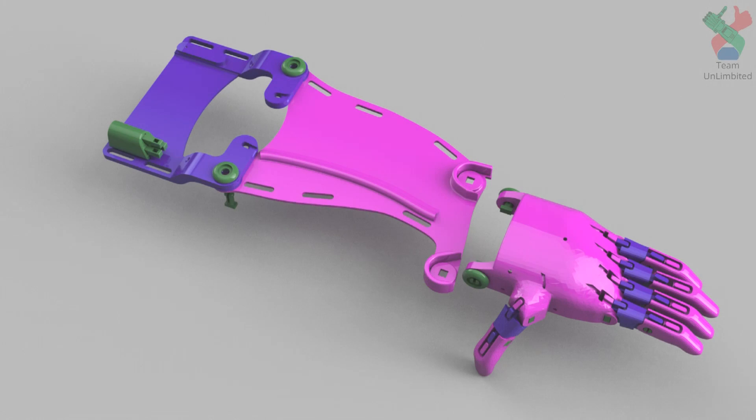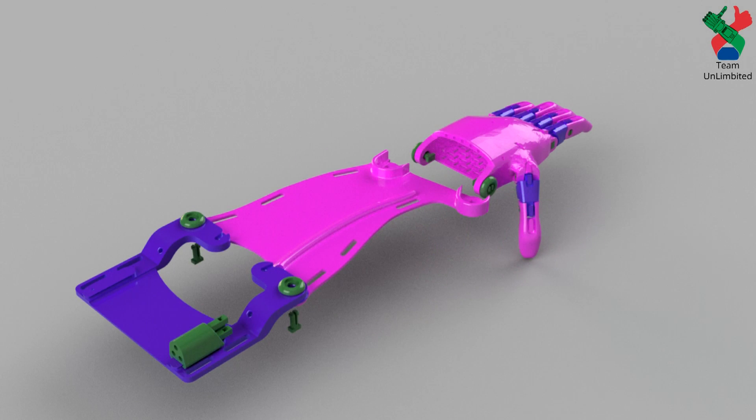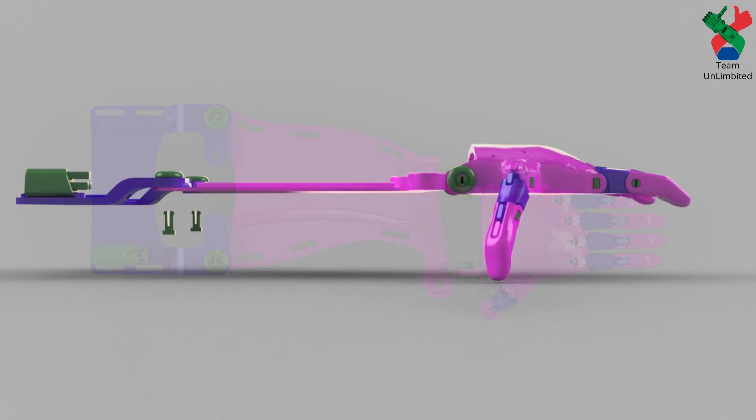We have the great pleasure of unveiling the Unlimited Arm, a brand new option for children that are missing an arm below the elbow. Designed to be easily printed, allowing print time to be 10 times faster than current available models.